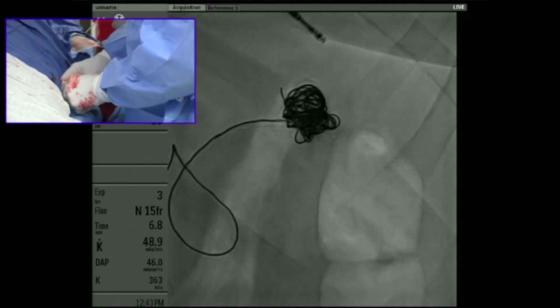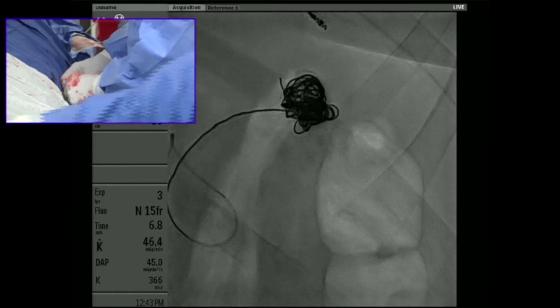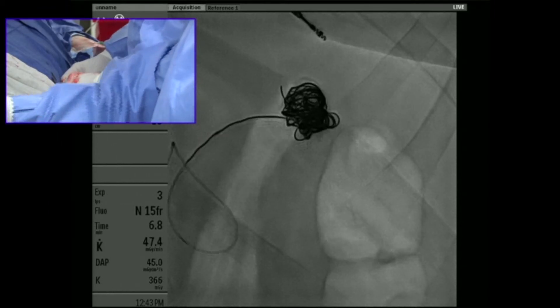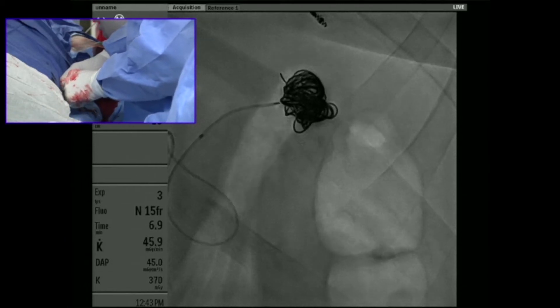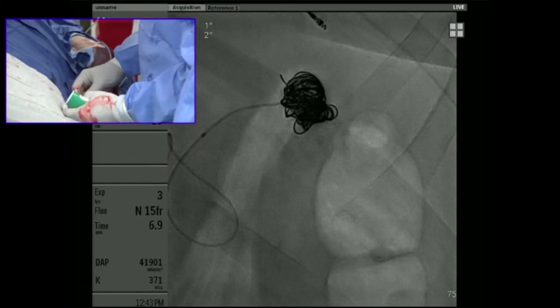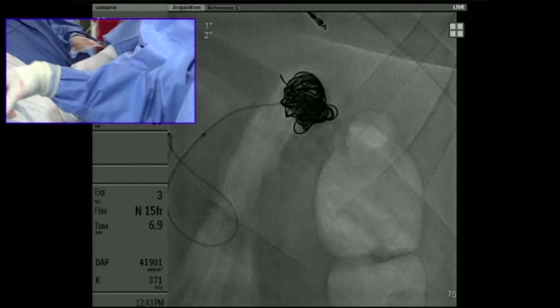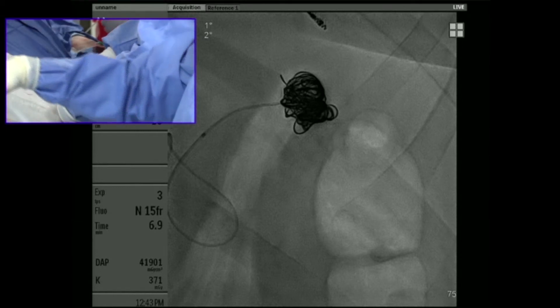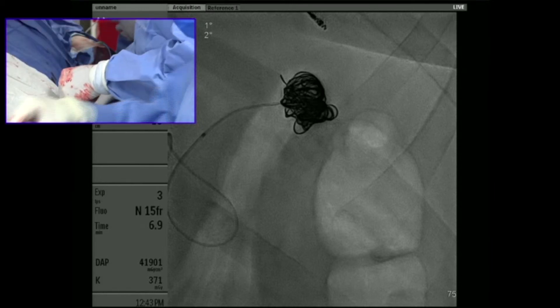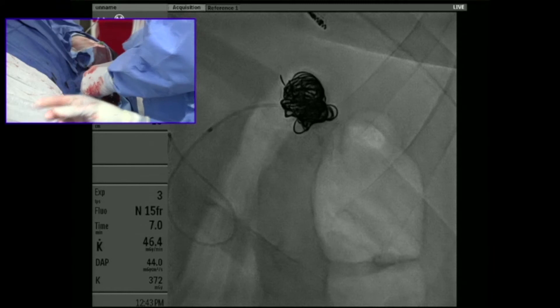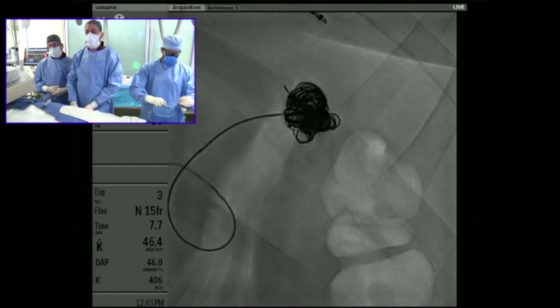If we embolize into the two or three outflow vessels, you would expect antegrade flow to the spleen to significantly decrease. However, collaterals — the short gastric arteries and gastroepiploic — will supply the parenchyma. So even though we embolize the proximal or mid splenic artery, we typically don't see infarction of the spleen in most cases.